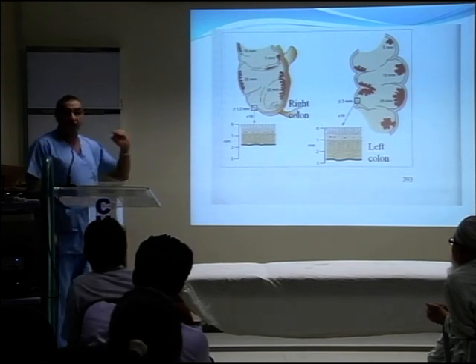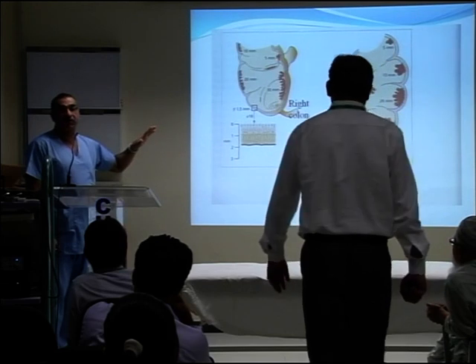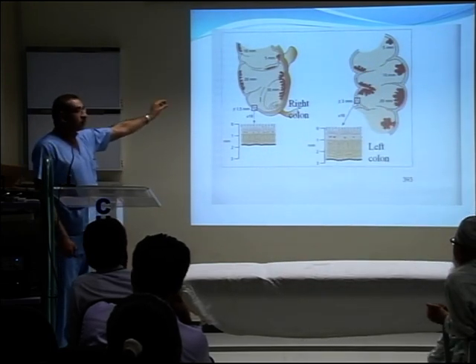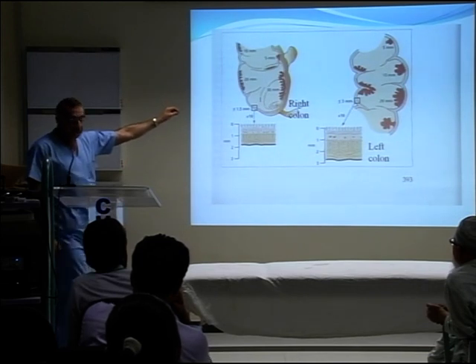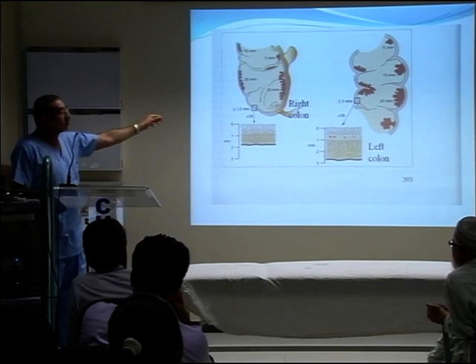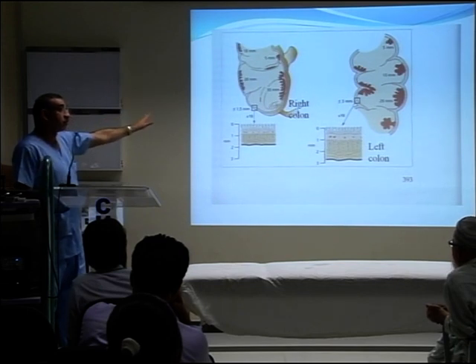One of the most important things is that in our department, there are no hot biopsy forceps. We've totally done away with them, because what people tend to do is catch a flat polyp in the hot biopsy forceps and completely burn it off, and by the time it is burned off, it has caused a full thickness burn or a perforation in the colon. So no hot biopsy forceps in our department.